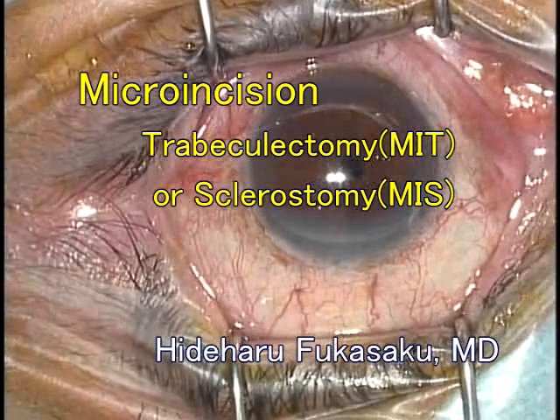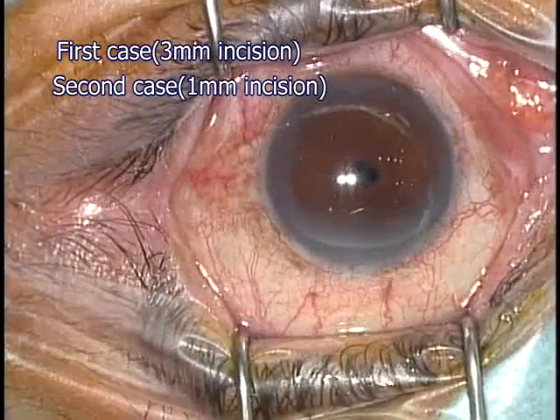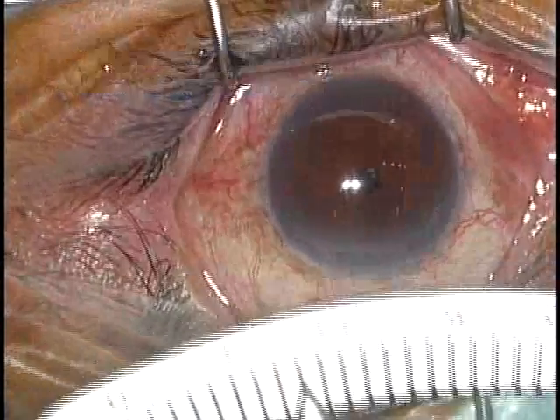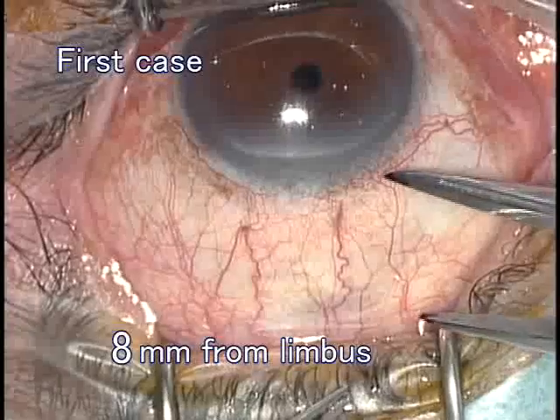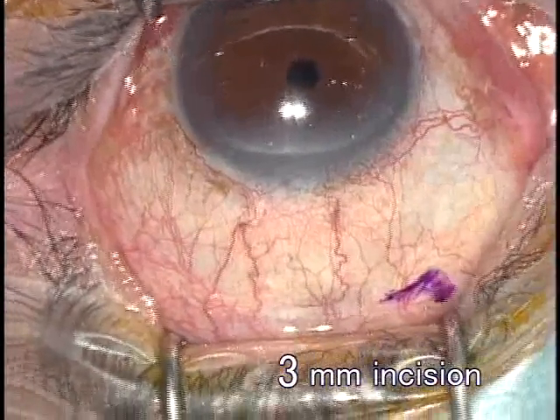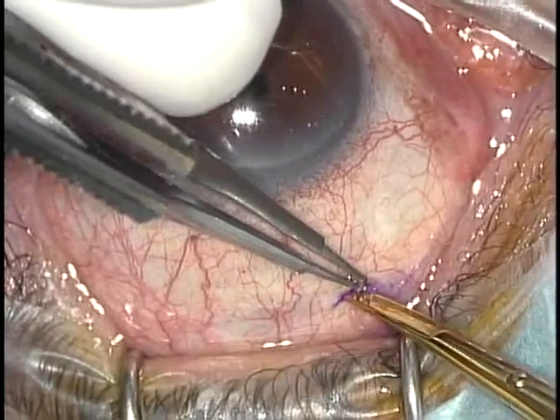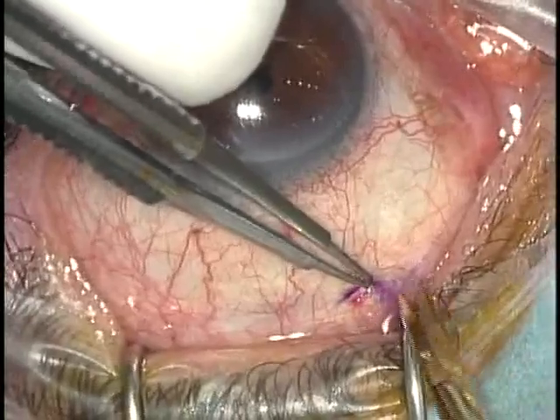In cataract surgery, we have changed from ECCE to phaco, and further to MICS, reducing the incision size from 8mm to 3mm, and then to 1mm. Similarly, in glaucoma surgery, we have changed the incision size smaller and smaller in trabeculectomy cases.